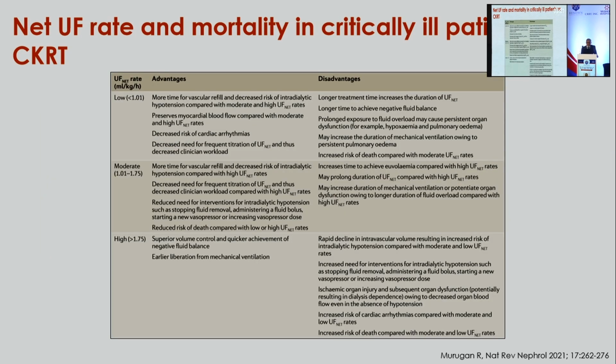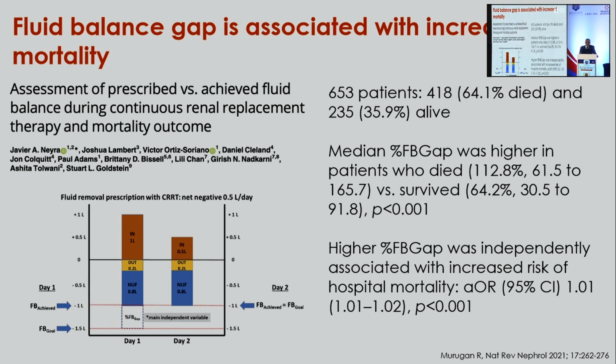Right. So again, putting all this in perspective, we do have some pros and cons of certain rates of fluid removal. The other thing is that we know many a time we are setting goals for fluid removal, but we may not be reaching those goals. And this is a study that was just published that looked at the assessment between prescribed and achieved fluid balance during continuous kidney replacement therapy.